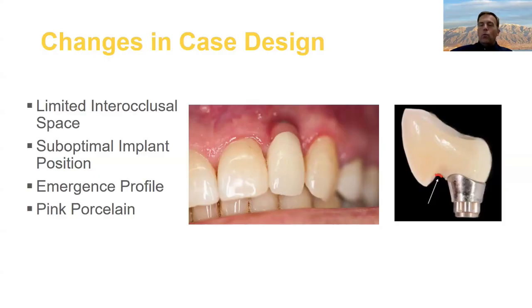For us in laboratories, the worst possible position is an implant that's placed buccal and angled buccal, especially in the anterior. This point has to be in a given spot for cosmetics. If the implant is here, it's very difficult to get a good result. Those are going to be the most difficult to restore. So every once in a while, you're going to get one of those situations, and you and the lab will just have to work together and figure out, okay, what is feasible? Depending on where the patient's at, you may want to do a mock-up of what you can do, like a plastic provisional or something like that.